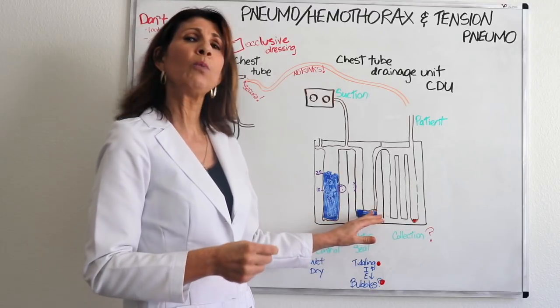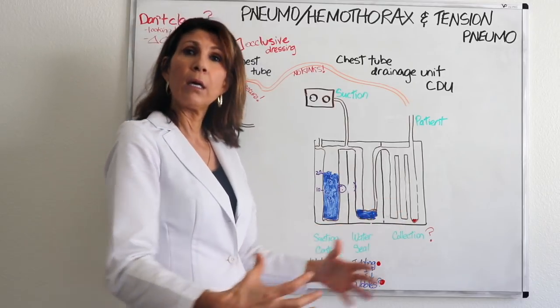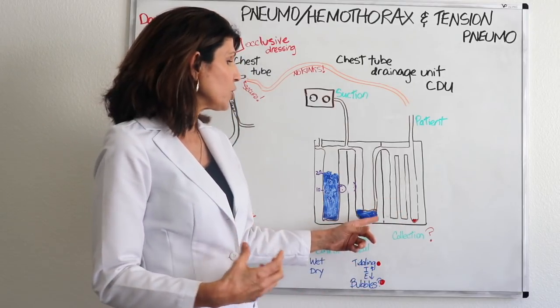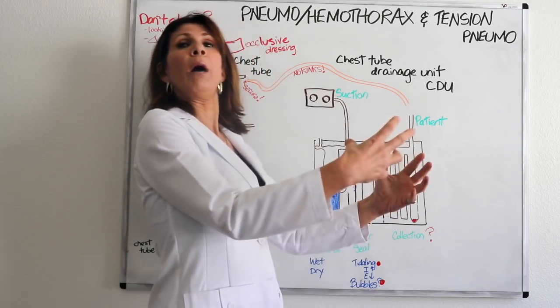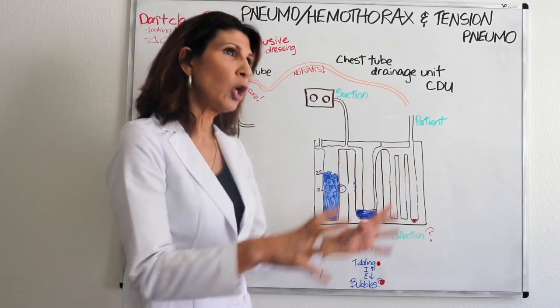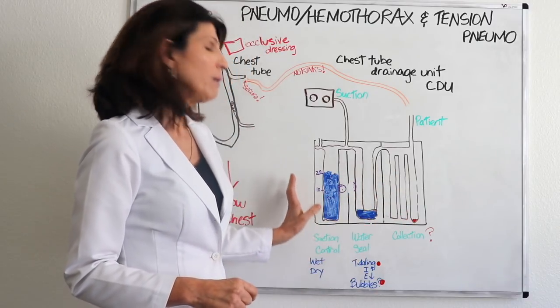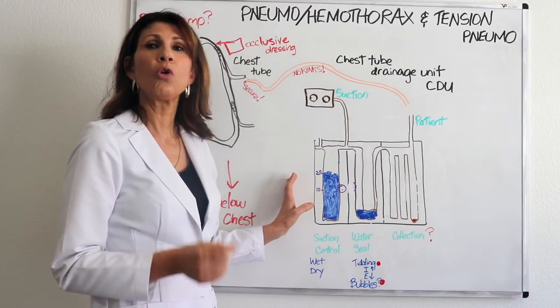The other thing that you can watch for is what's called tidaling. When a patient takes a breath in, so upon inspiration, the water level goes up, and then upon exhalation, that little water level goes down. So that's called tidaling. The last chamber is called the suction control chamber.